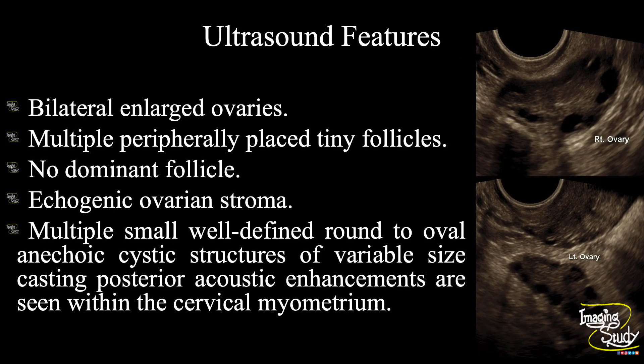In summary: bilateral enlarged ovaries with multiple peripherally placed tiny follicles without any dominant follicle are seen, forming the pearl string appearance. The ovarian stroma appears echogenic. Multiple small well-defined round to oval anechoic cystic structures of variable size casting posterior acoustic enhancements are seen within the cervical myometrium. These features suggest a case of polycystic ovarian disease with cervical Nabothian cysts.